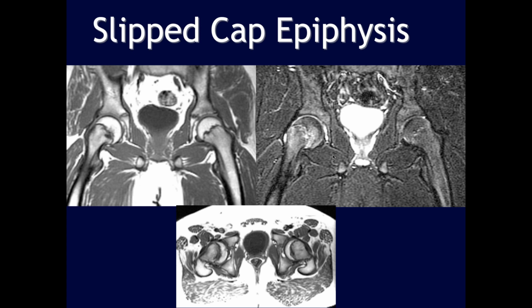One of the problems with these is when you pin them, you usually try to use individual wires. And nowadays, the screws that you use are hollow, so you can put a K-wire and position it and then pin it. If you try to manipulate these, you can cause avascular necrosis. It's a very tricky business.